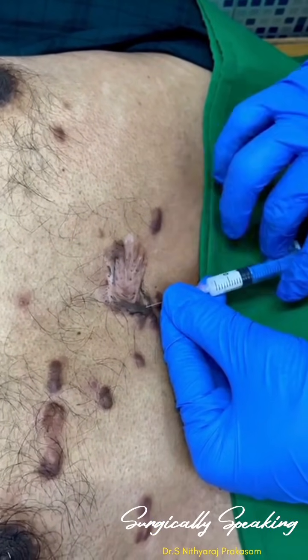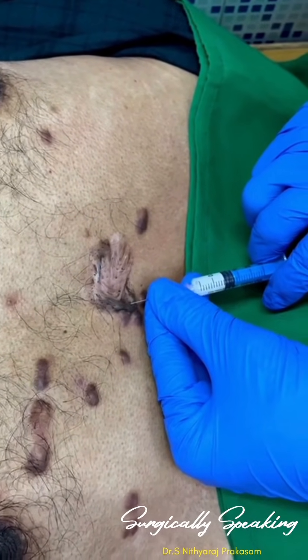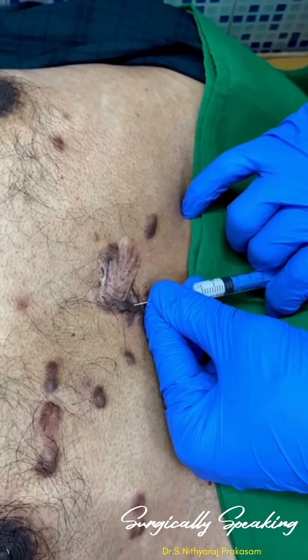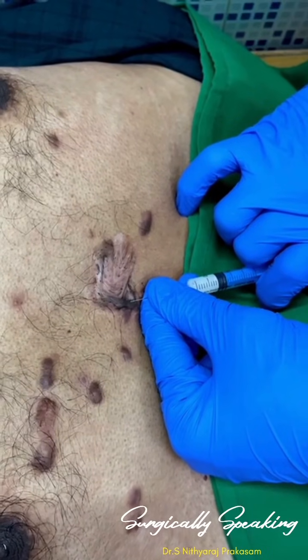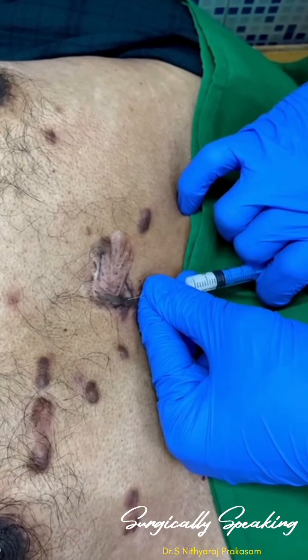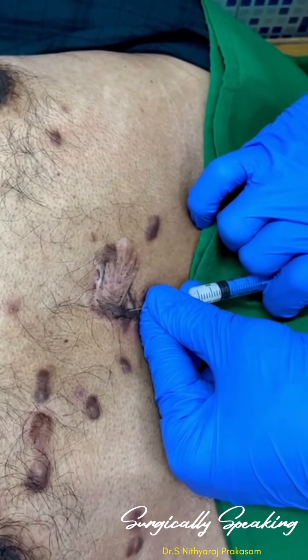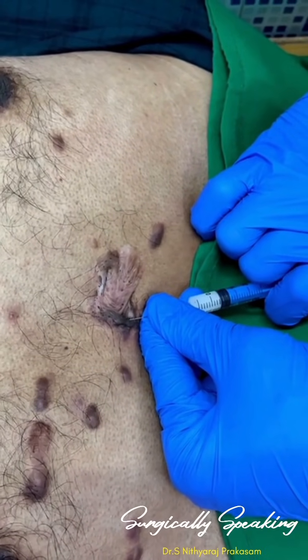Yes. Now I am injecting it inside. Now it will be very tough. It is not an easy injection because of the excessive, disorganized collagen tissue. There will be pain. The patient will have pain, so always make the patient lie down comfortably and then you should give the injection. You will have to use a considerable amount of force. I am actually using a lot of force. You will not be able to make it out in the video. And if it is difficult, that means you are in the right plane. If it goes easily, that means you are beyond the margin of the keloid, and that is the wrong method of doing it.